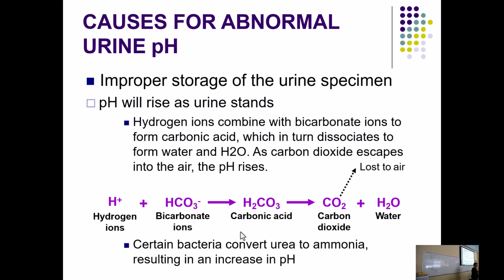By the time they get back to it, they're like, oh yeah, that urine. So they're going to label it, time it and date it for that time that they're labeling it, and send it down to the lab, okay? We don't know what's going on on the floor. We don't know what caused that urine to sit. It could have just been forgotten about. That happens too sometimes. But always remember you don't know what's happening on the floor, so do not get nasty about it. Don't get rude. You're not on that side of the bed, okay?